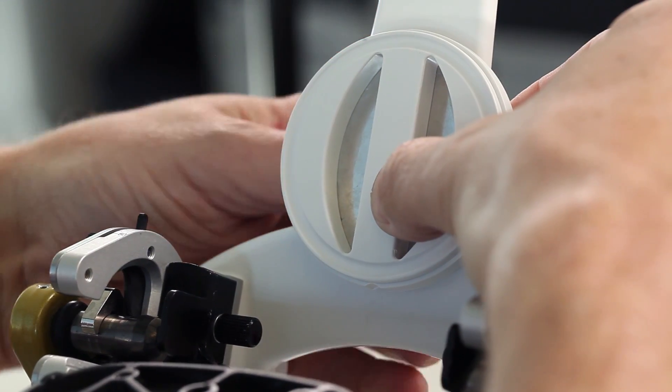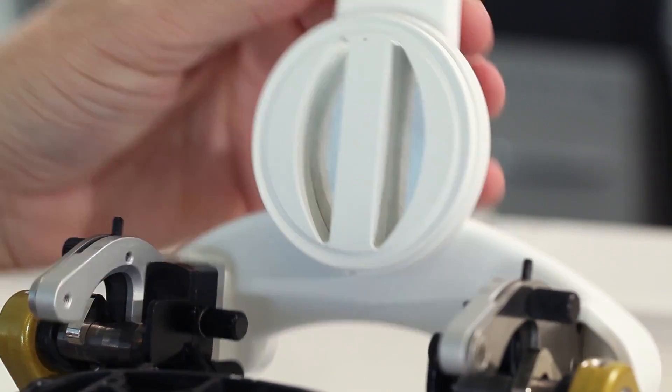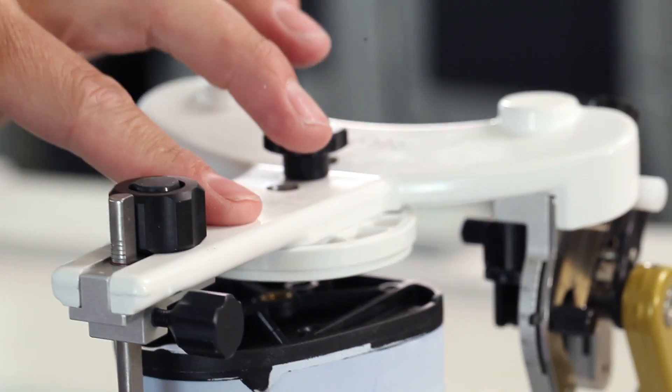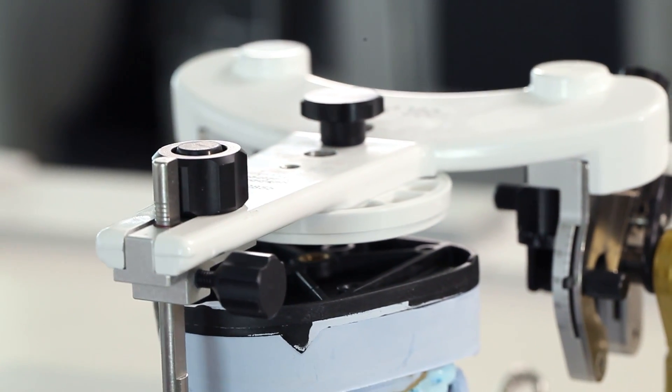Mount the maxillary model in this position using the magnetic base block. Articulation is done in the conventional manner with or without a split cast system.